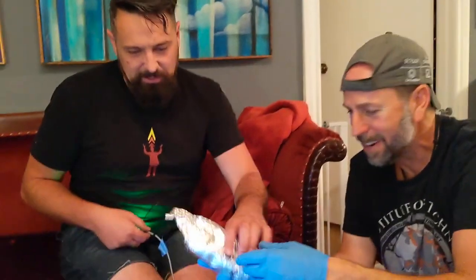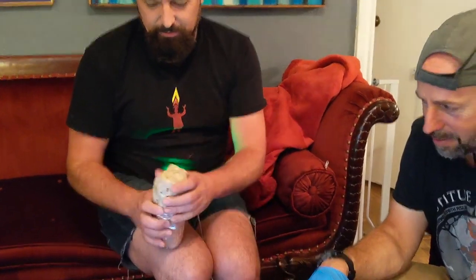I'm trying to hold this and grab a burrito. So there we go. Biocompatible, my friend. I haven't eaten anything in a long time. We're going to see if we can see what comes into the stomach. Okay, swallowed something. I think we're just at the tail end of the burrito. So our voltage is down to 3.11 volts — that's very low voltage. We'll start doing sleep cycles and waking up later and all sorts of cool stuff. We're going to have total loss of signal. This is pretty cool. You get to enjoy your burrito. First in-human. That's pretty cool, man. Yay! First in-human, Tori. Have a good job. See you guys, dude.